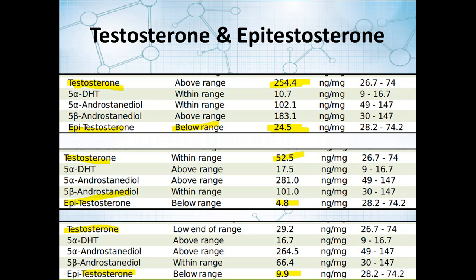So it's a real rough approximate, but I like to think of the epitestosterone as a potential baseline value for these gentlemen, to say, okay, this guy was probably low for testosterone, and presumably there's a baseline value anyway on testosterone, but you can see he's getting a lot of exogenous testosterone. See, this guy's testosterone ratio is about 10-1. So if he was trying out for the Olympics, he'd be kicked off the team for supplementing. This gentleman here, again, 10-1, that's problematic. Now, it's problematic if you're trying to get in the Olympics.